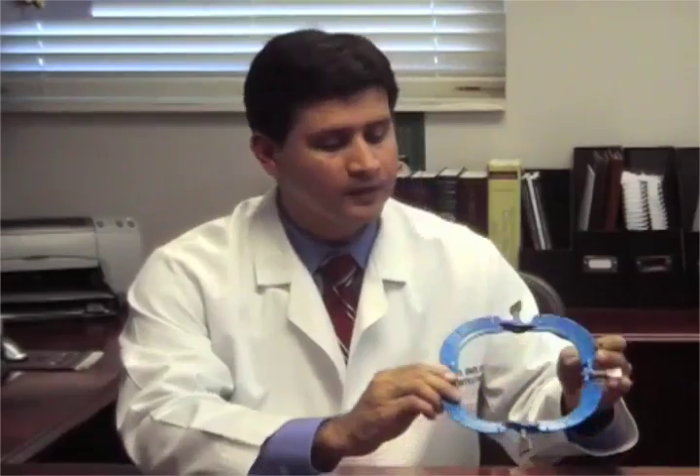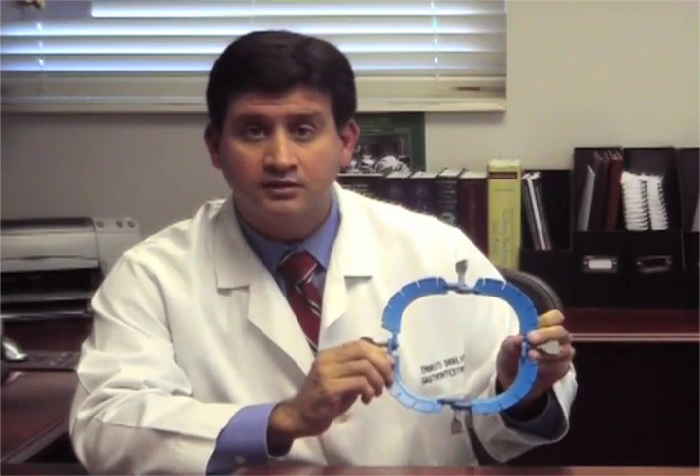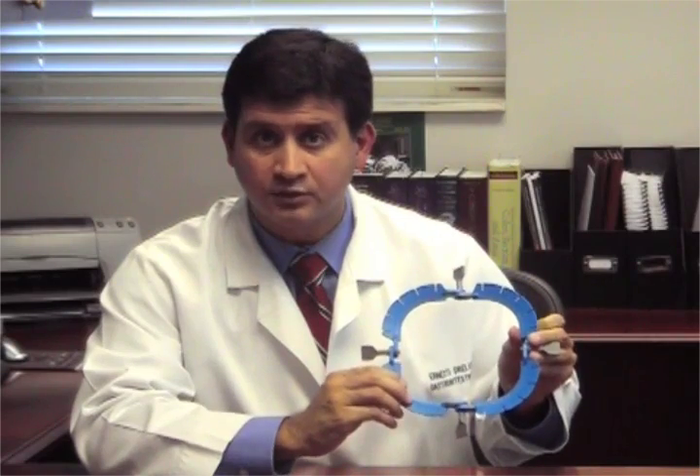For colorectal surgery, I like to use the model 3307. This is also known as the square model. I like it because it fits nicely in the perineum. It completely surrounds the anal canal and then allows for circumferential retraction.